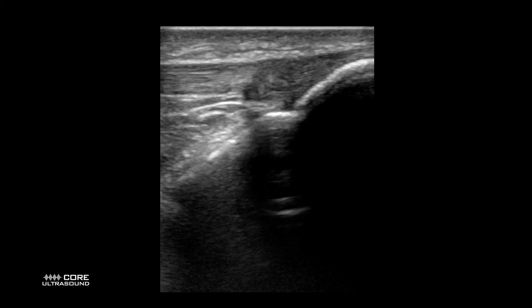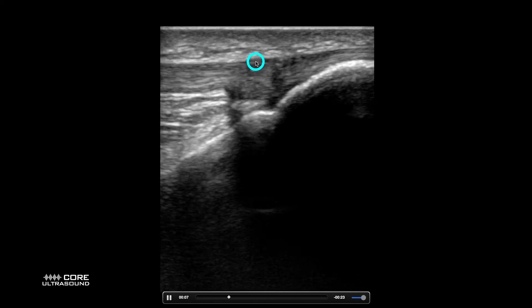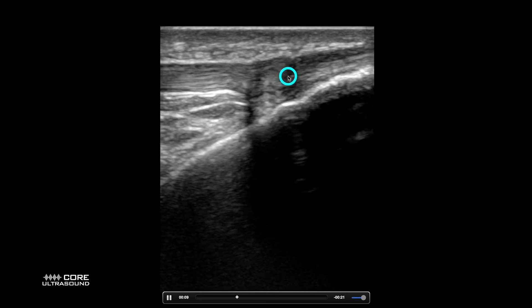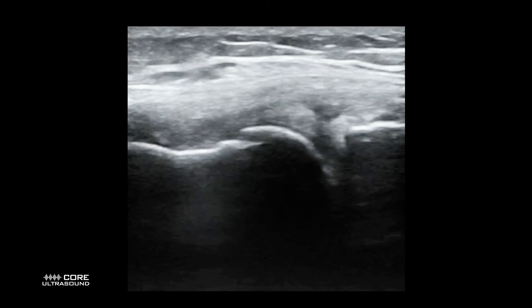Down here we have a patellar tendon rupture. This right here is the tibia, and you can see how there's a bunch of black stuff — it's a bit bunched up right here, with lines going through it. This is what a tear looks like.